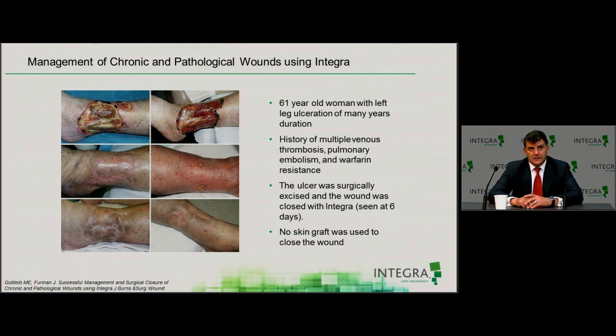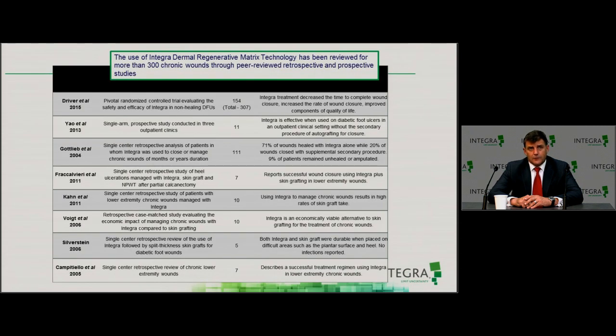So one of the options here is obviously to take them to the OR, debride them widely, and use a dermal regenerative template. And I think there are some actual cost savings with this type of therapy for these large ulcers as well, because if you don't heal them, they stay in the outpatient environment forever, fundamentally.